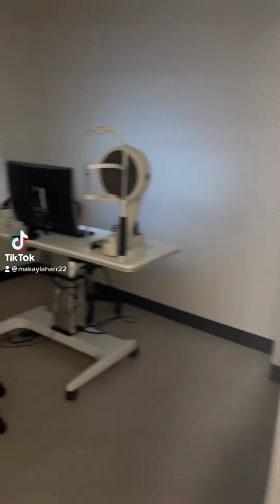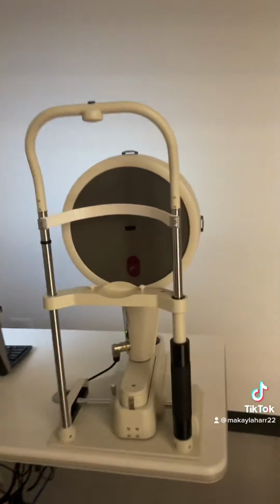Day in my life as a Pentacam. I'm turned on bright and early in the morning by Michaela Haar, who is a third-year optometry student. We are able to perform our work together at the Kentucky College of Optometry.